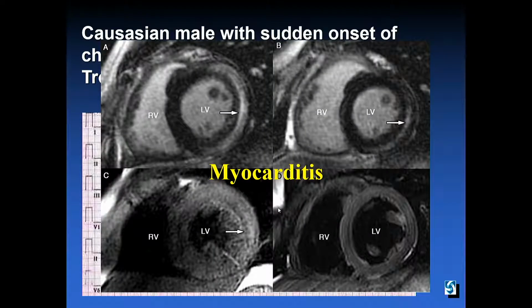So this is the picture. Now what turns out is this is really a 19-year-old college student who presented with acute chest pain. So clinically, the suspicion for myocarditis was always there. One also has to entertain the possibility that it could be some kind of coronary spasm that led to infarction and elevated troponin. But I think the overall clinical picture was leaning towards myocarditis.